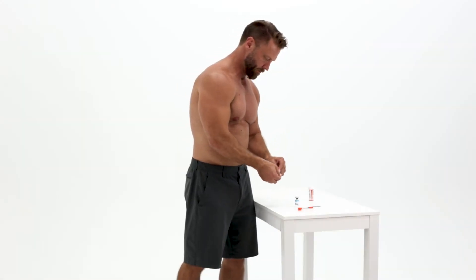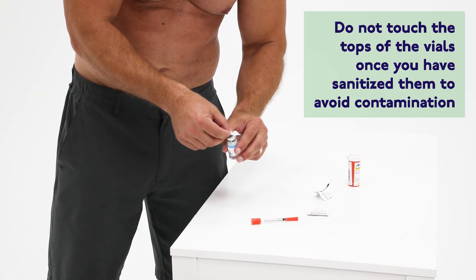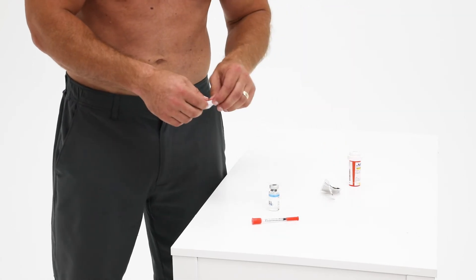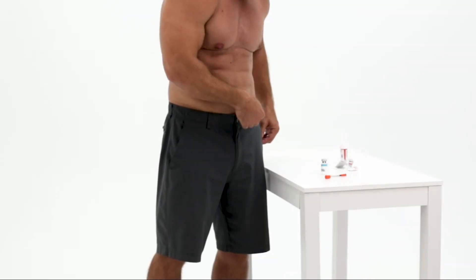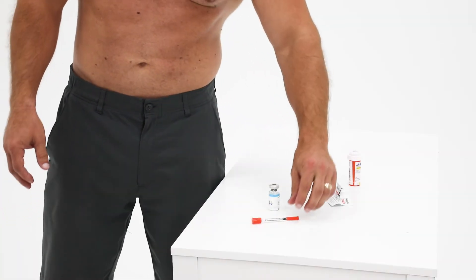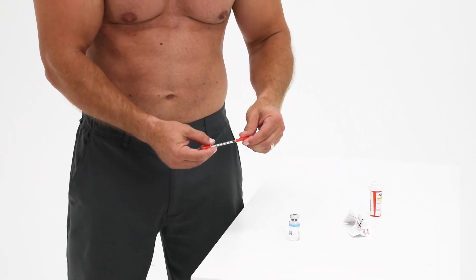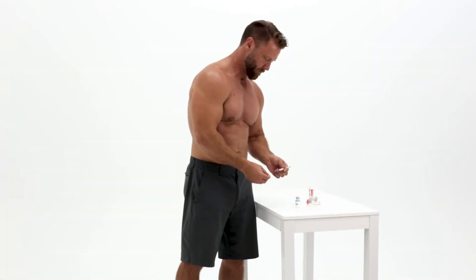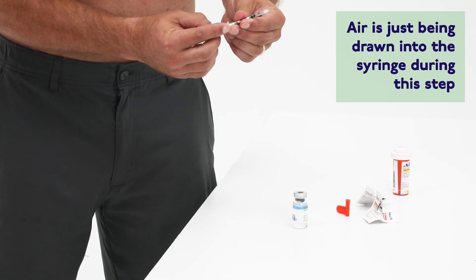Start by wiping the top of the vial with a new alcohol wipe. Then wipe the injection site on your body with a new alcohol wipe. Next, take your 30 or 31 gauge syringe with needle and carefully take off the caps on both ends. Pull back the plunger to the black line that your health care provider has prescribed.